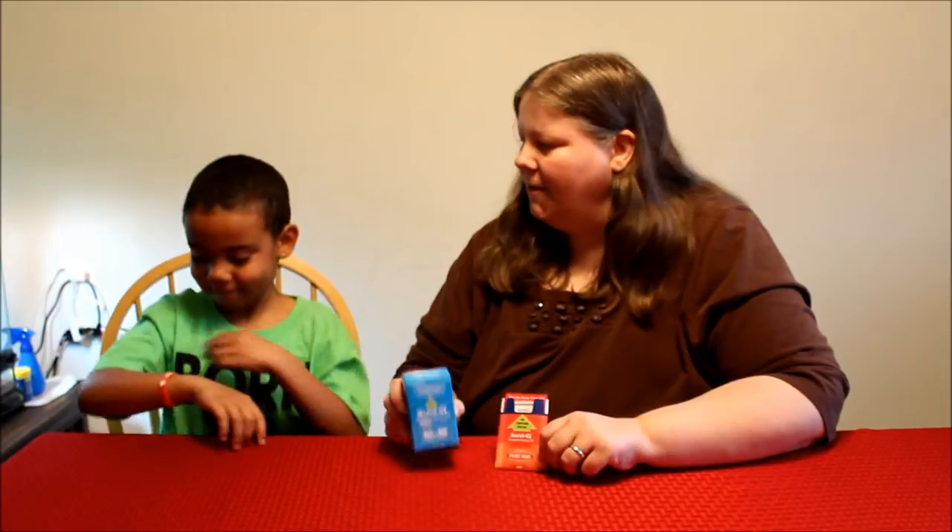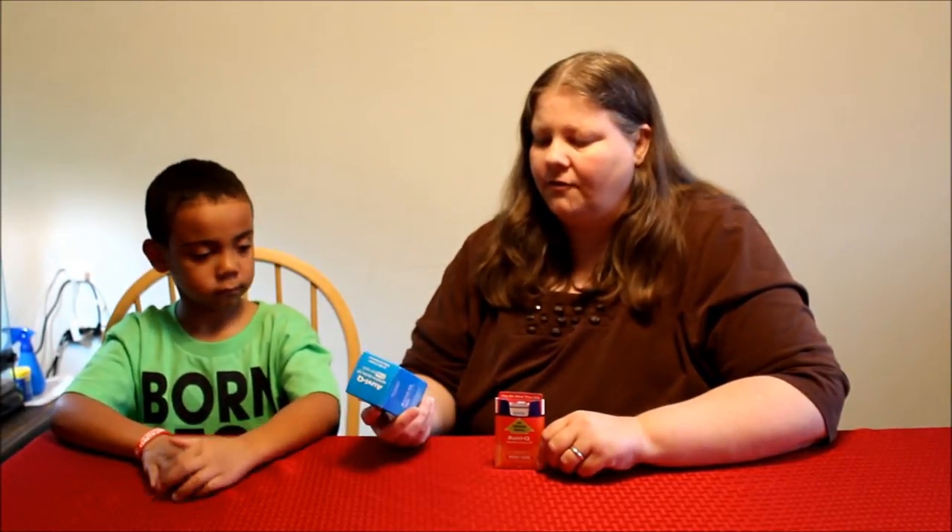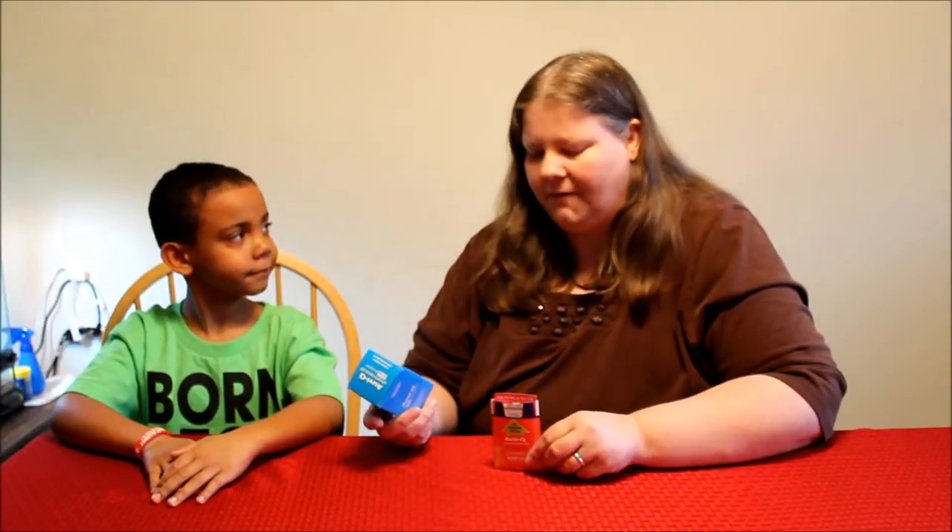Hi everybody! Today we picked out the AviQ Epinephrine Injector from our pediatrician, Dr. Moffitt.